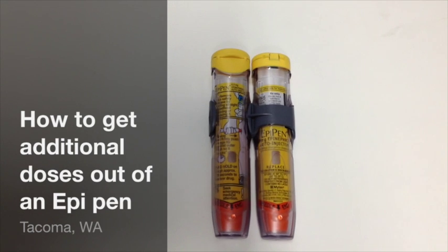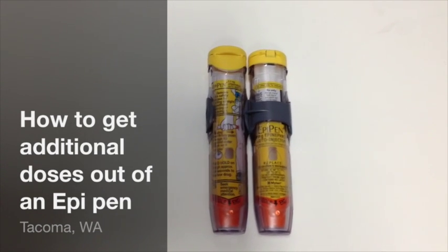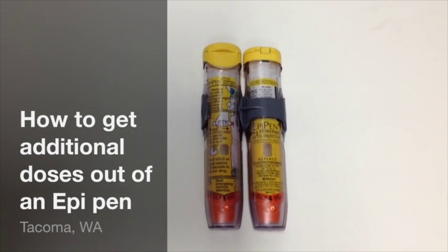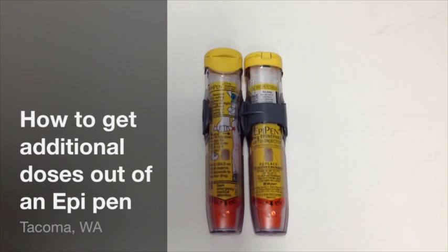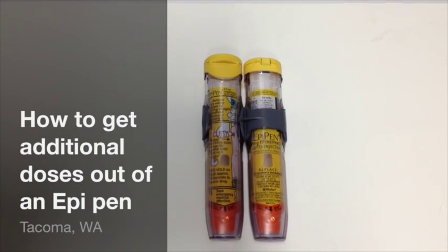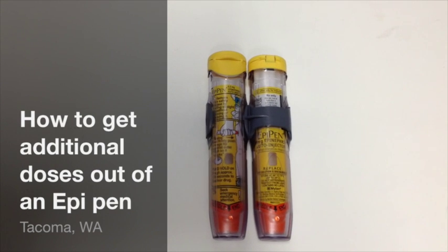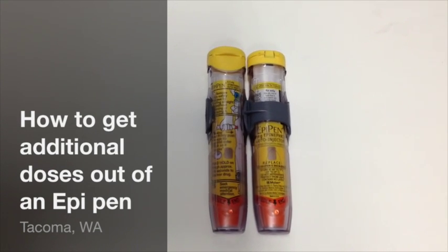So what we're going to show you here is how to open up the EpiPen and get further doses out. There are exactly 2 mLs or 2 milligrams of epinephrine in each EpiPen. So that's just a little over 6 doses.